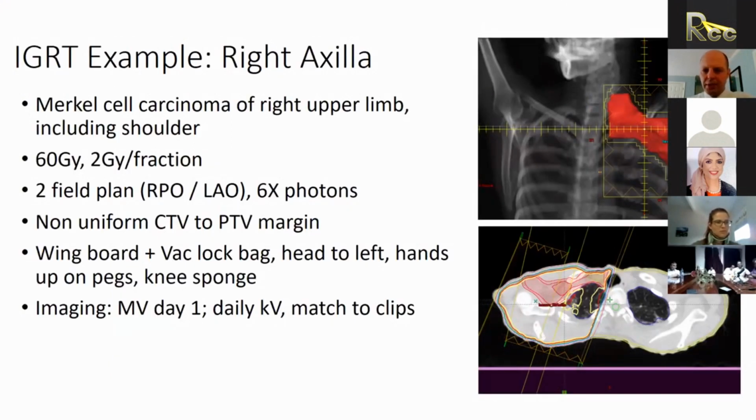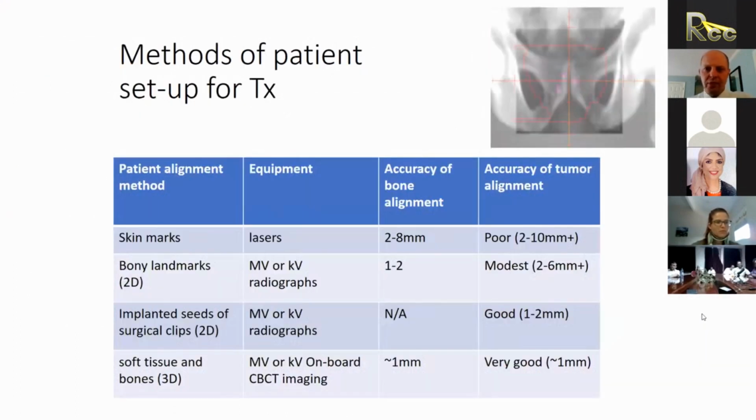I don't know if, up until this point, there are any further questions that we could address? Well, we had one question from our friend Bastun. He asked how much time the CBCT takes, and how many slices it will take.